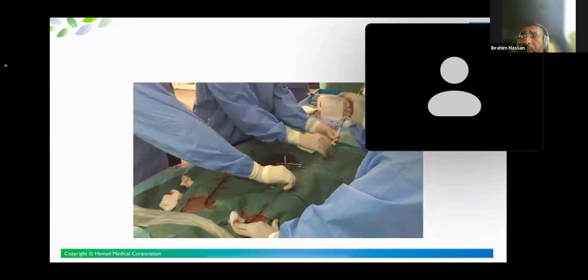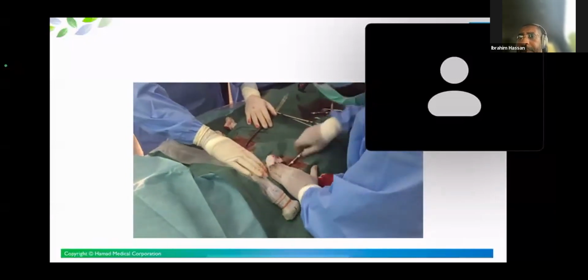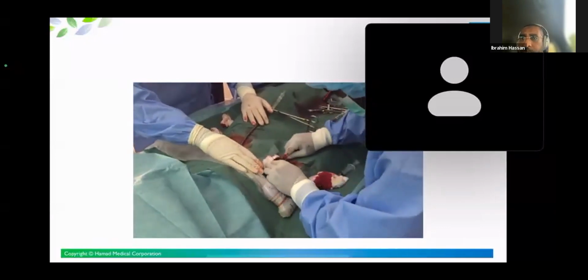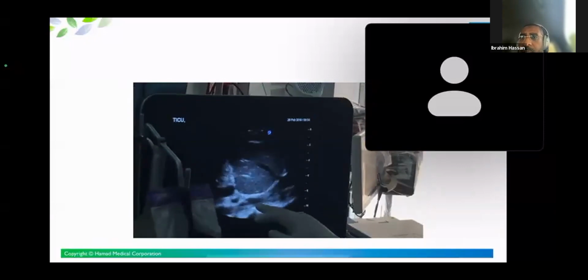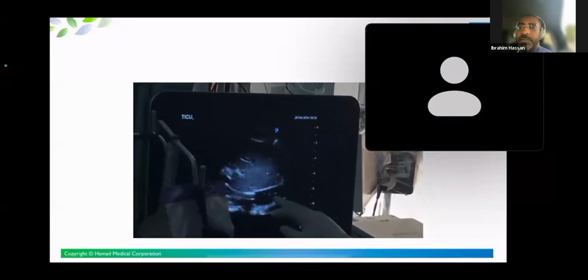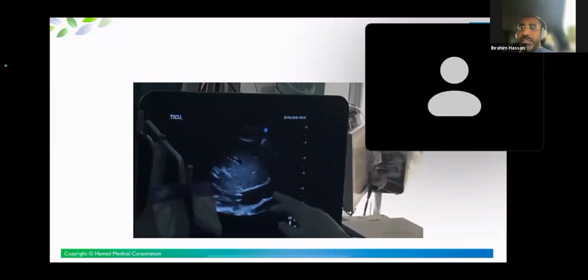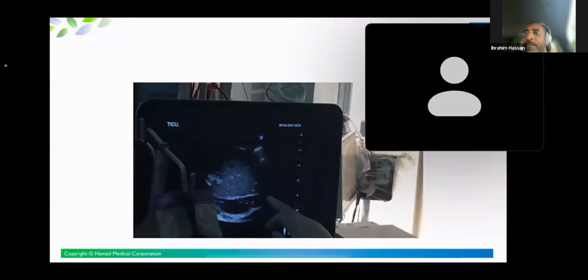And then you put the other drainage cannulae through the other femoral vein, goes smoothly and easy. And you do the same, you flush it to make sure it doesn't get clotted. You confirm the position by ultrasound or fluoro. In this view, you can see it in the right atrium, the return and the access in the cava IVC. So it's something that can be done by intensivists, can be done by surgeons.